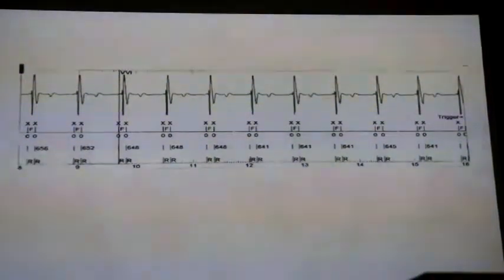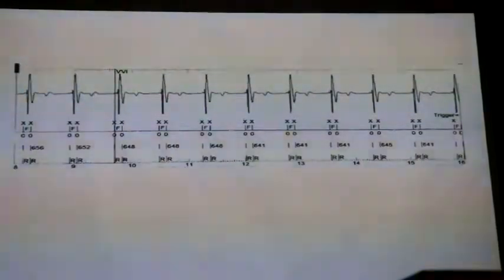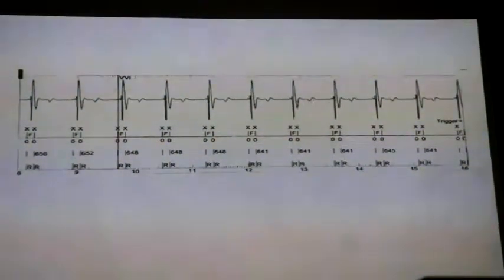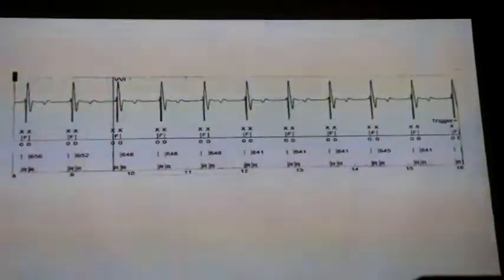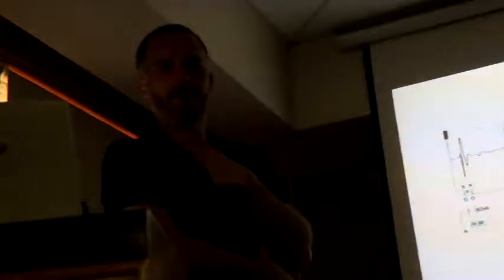Old morphology was tip and ring. The new morphology is coil to can. We always had the notion that when it came to discrimination, whatever discriminated, the device always used the bipolar signal from the tip and ring, while the wide range is the unipolar signal from the tip to the can. Can it be used for any morphology discriminator? Yes, we use coil to can as our morphology discriminator. RV coil to can.